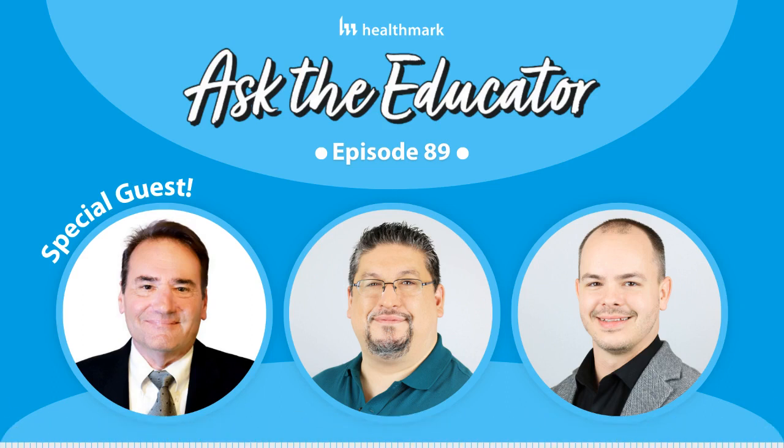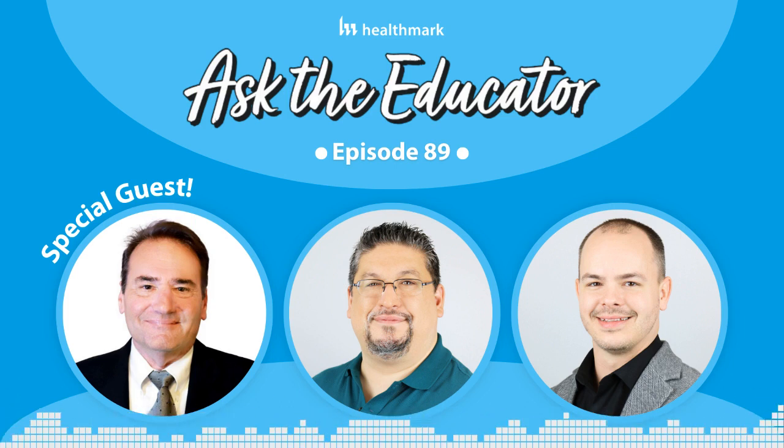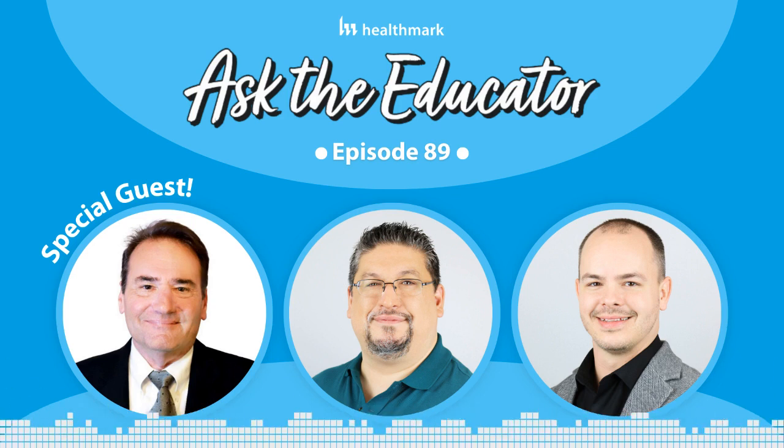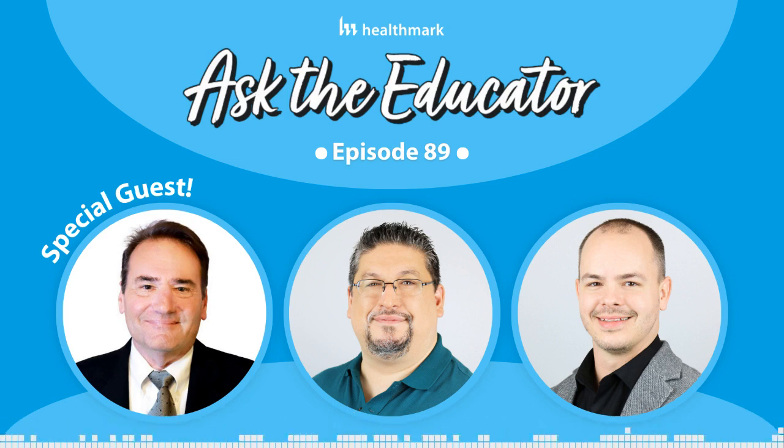Yeah, good question. And it was interesting during the webinar that, not surprisingly, we had a lot of people from healthcare facilities, and so I had a lot of questions like that. But ST98 really is meant for the device manufacturers. And what's different about ST98 than any other document we've had before this is it's actually focused on what the manufacturer is required to do to demonstrate, to validate that, in fact, the instructions they're providing to the end user result in a clean instrument.